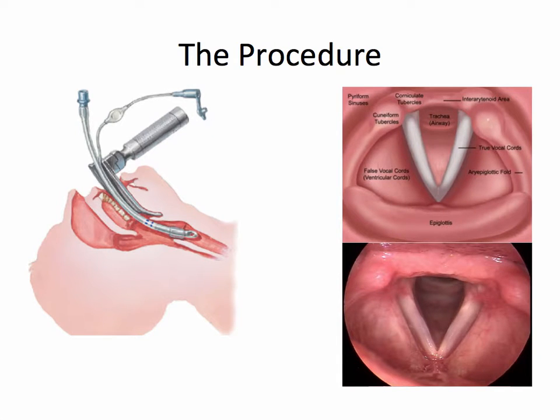During intubation, the nurse's primary role involves monitoring the patient and handing the proceduralist necessary equipment. The proceduralist will insert the laryngoscope into the oropharynx and search for the vocal cords. The endotracheal tube is then passed through the vocal cords and into the trachea. On the right is an image of the anatomy, as well as a realistic view of the vocal cords.